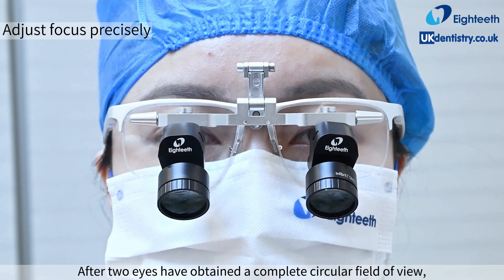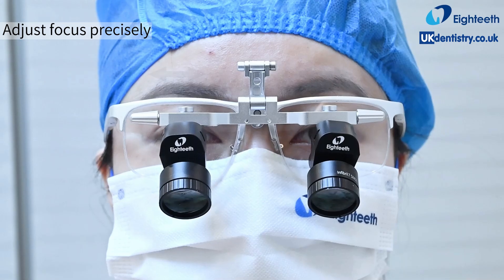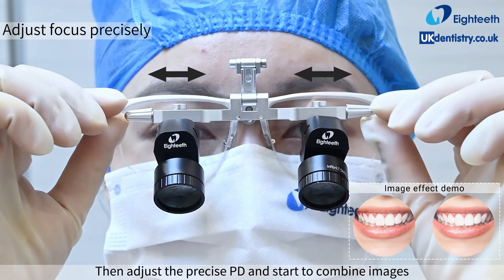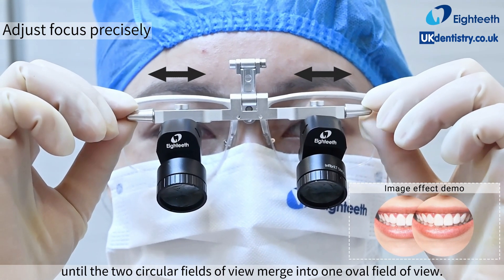After both eyes have obtained a complete circular field of view, keep seeing objects at a suitable working distance clearly. Then adjust the precise PD and start to combine images until the two circular fields of view merge into one oval field of view.